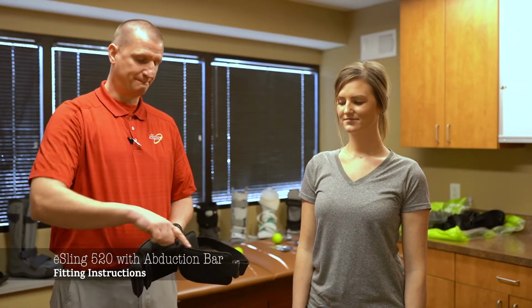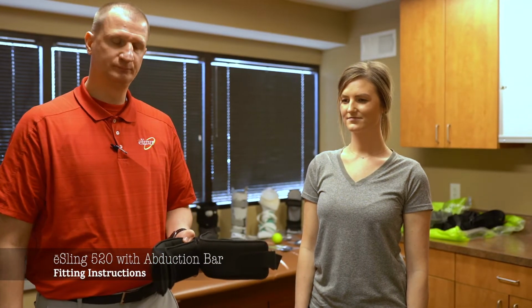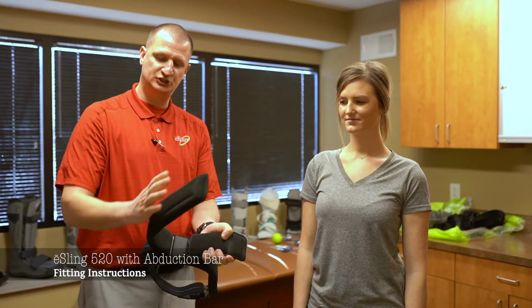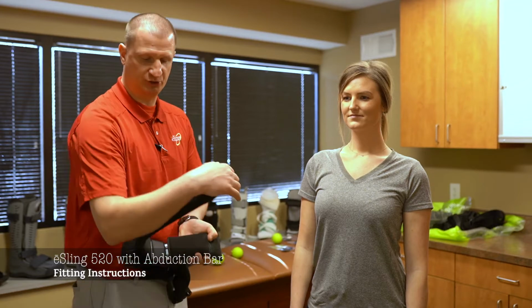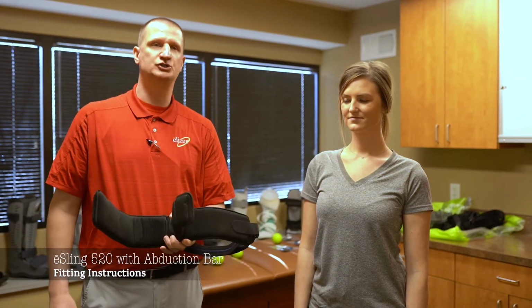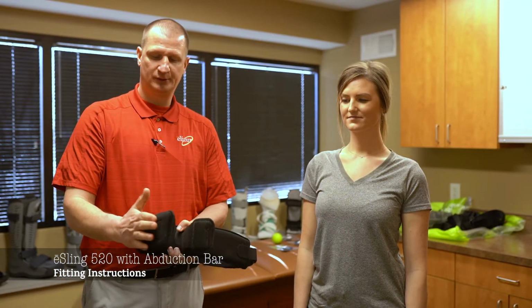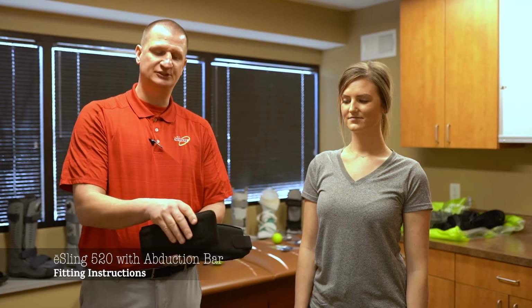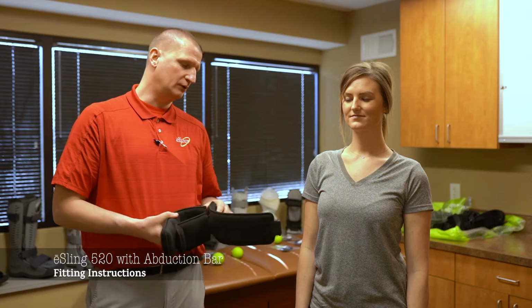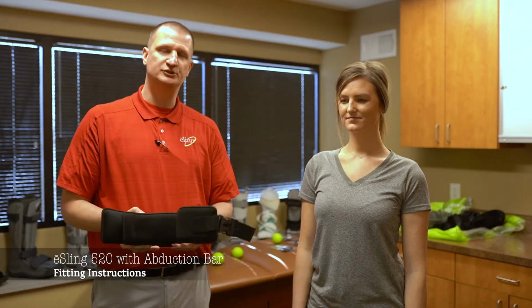You're going to have the rail that actually curves and gets molded onto the patient. You're going to have the arm positioning arm, which the patient's arm is going to go onto, and then you're going to have what's known as the stability strap. This is going to be brought to the arm positioning rail to help stabilize it so you don't get any movement while the patient is wearing it. This could go on the right or left, and we're going to do multiple positionings with it.